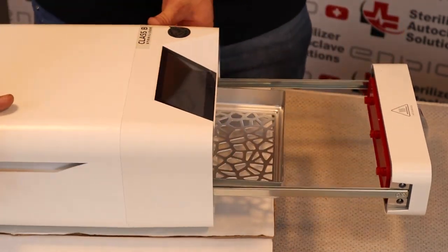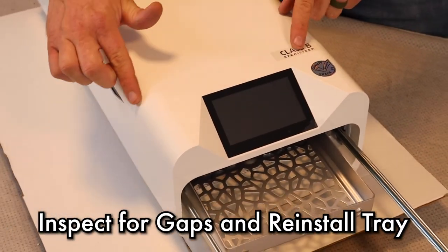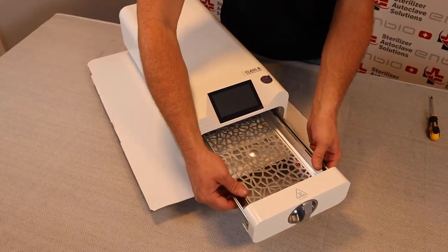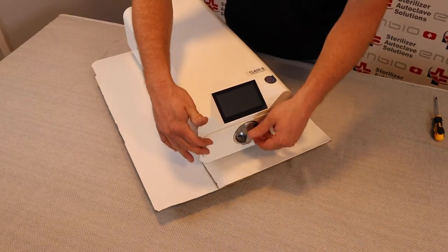Once we are done, we want to do an inspection — make sure there's no gap. If everything is good, reinstall our tray and test our unit.